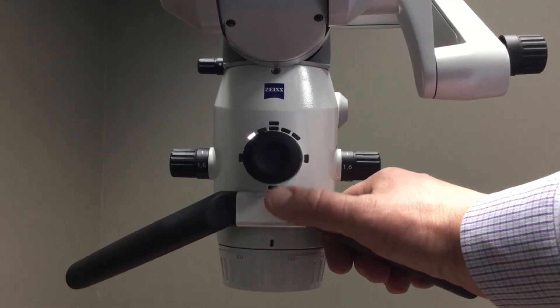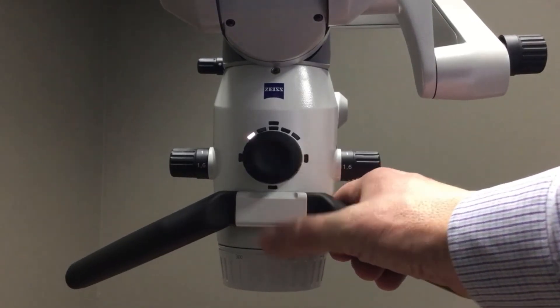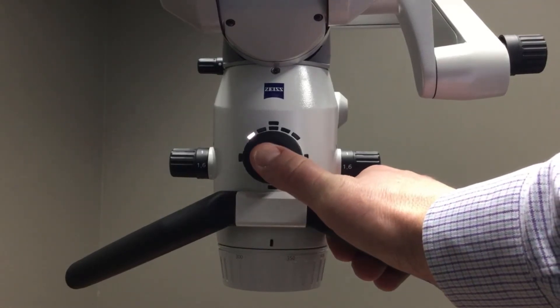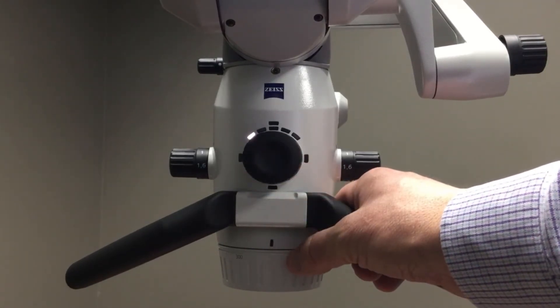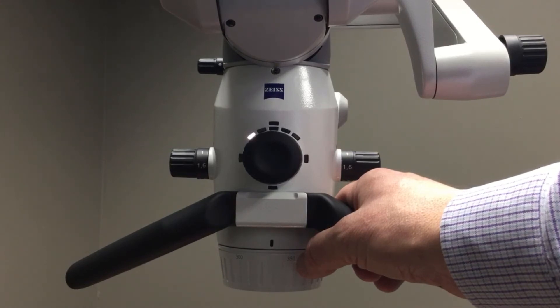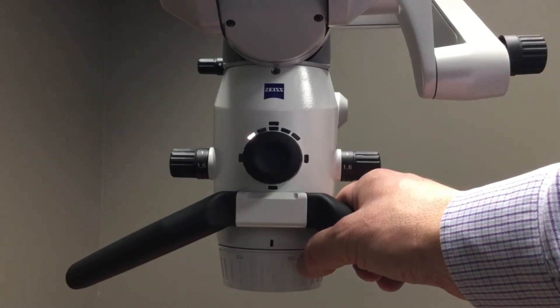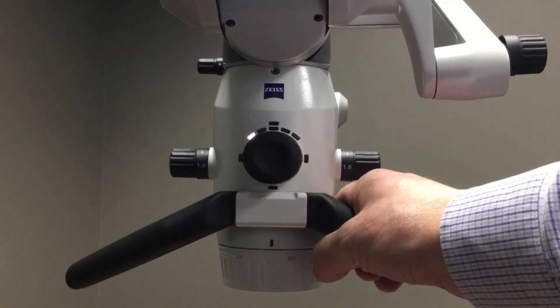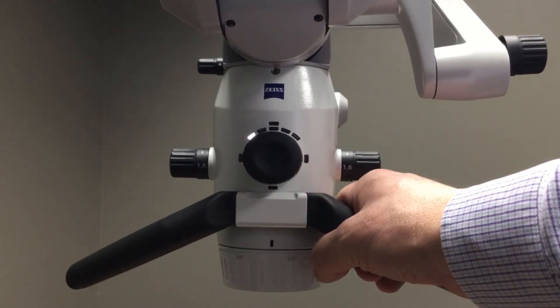To capture a still image, I would simply bring my thumb and just tap the center of the wheel, and that would fire the camera and capture that still image. To initiate a video recording, I would simply press and hold the wheel for a brief second, and that would start the video recording. To stop the recording I would simply press the wheel one more time.